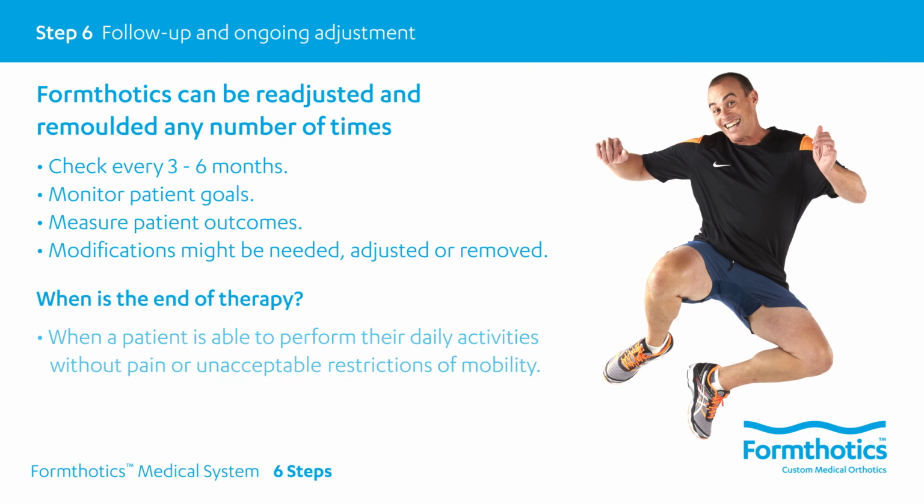The end of therapy is when a patient is able to perform their daily activities without pain or unacceptable restrictions of mobility. Until this time, the patient needs your assistance and regular follow-up.